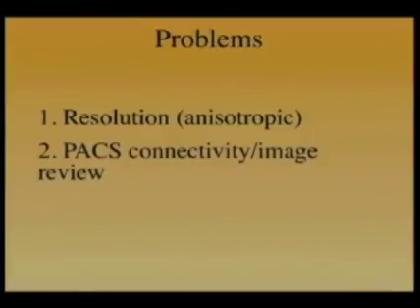A second problem is one of PACS connectivity and image review. Currently, there is no DICOM standard for 3D ultrasound, although I'm told that that is probably around 6 months off. Currently, there is no way to take these 3D data sets and view them or manipulate them on a standard PACS. What you have to do is use proprietary hardware and software offered by the ultrasound vendors in order to interact with the 3D data set.